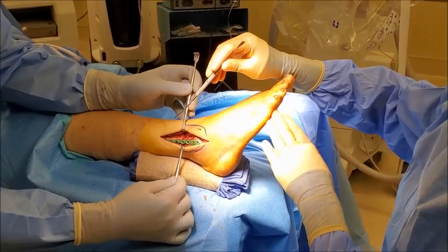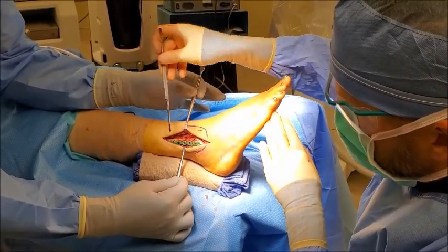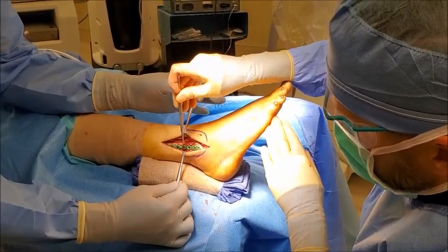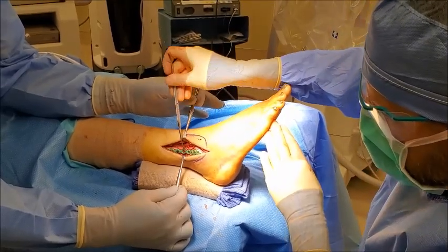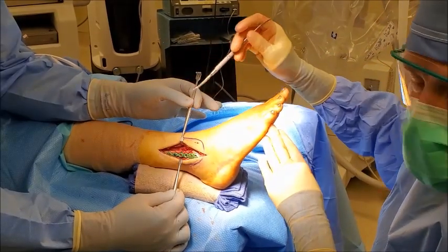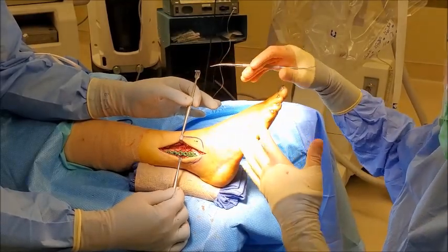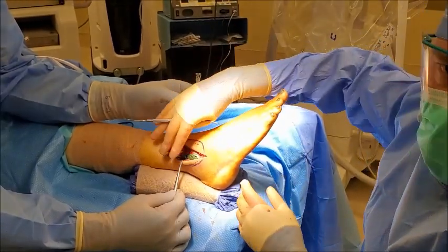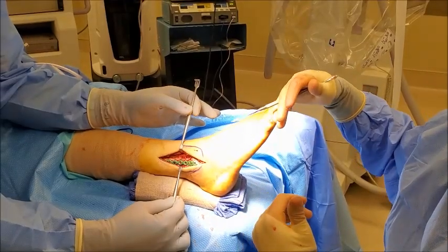We've completed the repair of the fibular fracture. You can see a small screw here crossing the fracture line in this orientation — you can barely see the fracture now underneath. Once we fixate that small screw, we put this plate over the surface, and that holds things together. That can stay in for life. These plates are all made anatomically, meaning they mimic the bone's natural anatomy, so it's very rare that a patient would feel irritation, as compared to what we used to deal with with older screw technology.